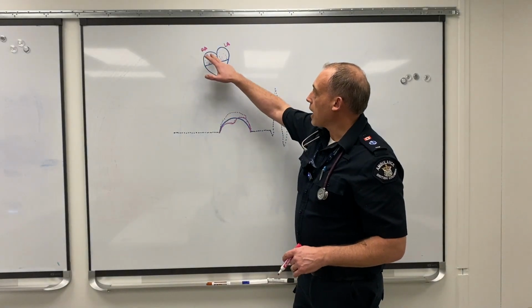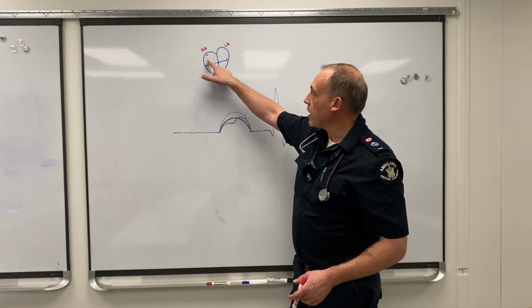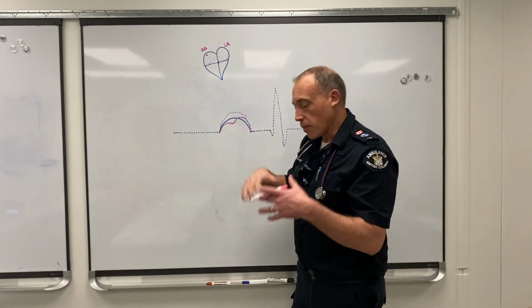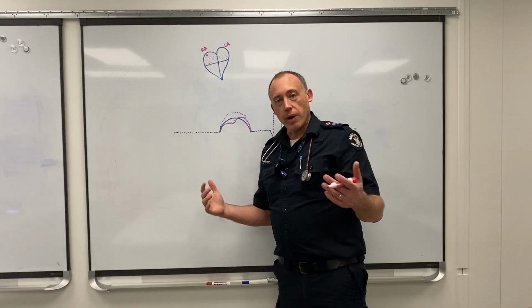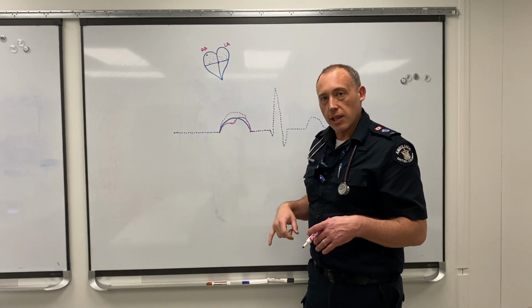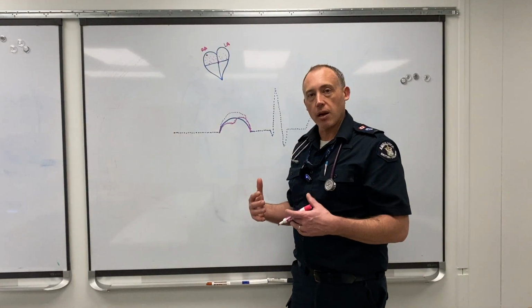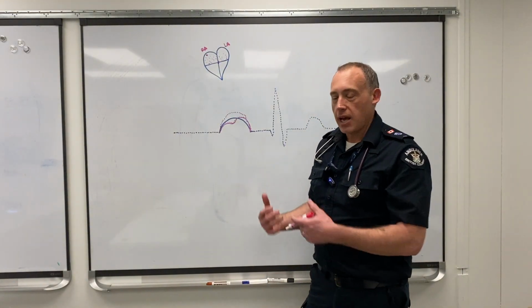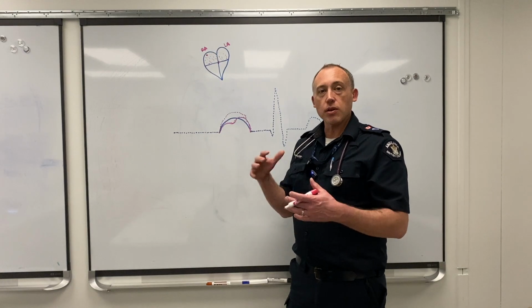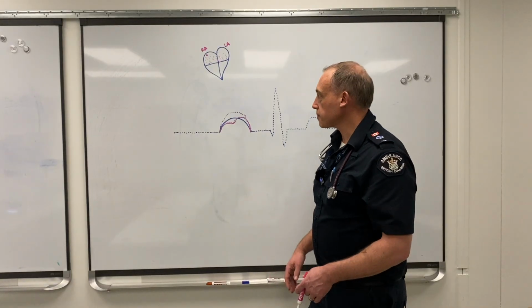So in P pulmonale, where we have this large, big one from the right atrium, that can happen if this right atria has to grow. What would cause that? If your tricuspid valve between your right atria and your right ventricle was thick or crappy, it's going to take a lot more work to push that blood through. So your right atria is going to grow and get bigger. If the blood from the right ventricle is having a hard time going through the lungs, it's going to back up, and that pressure and volume can back up into the right atrium, and it's going to grow again. Where do we see that? Pulmonary disease. It has a tough time getting blood through the lousy lungs, so all of a sudden that backs up and you start to see those things grow, and you can see this P pulmonale. So that can be a sign of somebody with some respiratory disease.